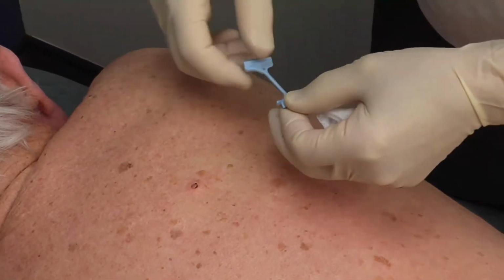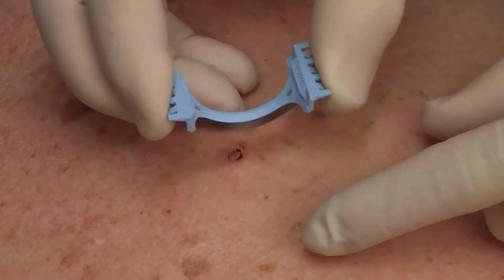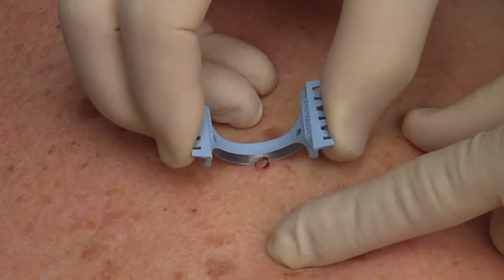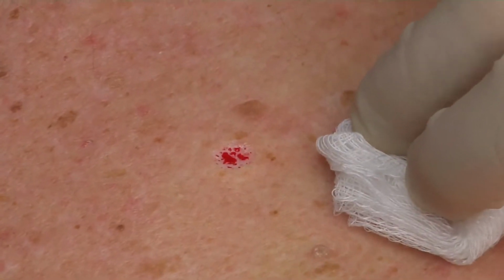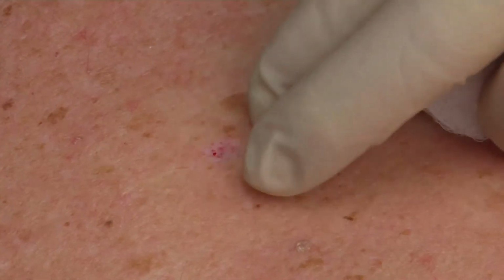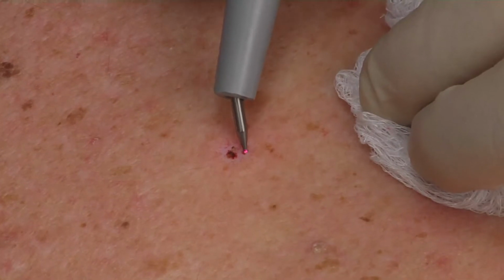And then we take the DermaBlade between the thumb and the forefinger, bending it a little bit, and then the skin is stabilized here. The lesion is removed by advancing into the lesion with a rocking motion, angling down, and then angling up. And that removes it right away, leaving a clean saucer-shaped base, which is treated with a styptic, such as 50% aluminum chloride. If there's any residual bleeding points, then those are lightly treated with the electrodesiccator, and the specimen goes to the laboratory.